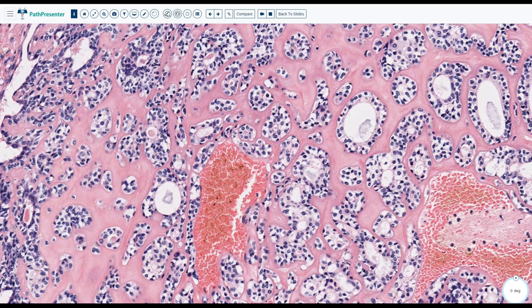The clearing, is it fat or what? What makes the clearing in the cells? Excellent, Mariam. Glycogen, yes, glycogen. And that's why some people call it glycogen-rich adenocarcinoma. You'll find that people change it to glycogen-rich. But again, don't use that. Say just epithelial myoepithelial carcinoma based on these two components. It's usually similar in male and female, very slightly more common in female.